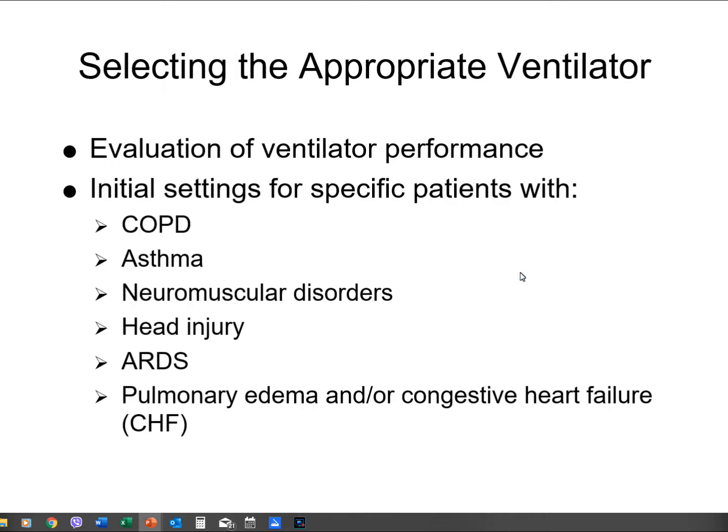So, there are times where certain bosses will assign someone to look at, let's say, the intubation tray, make sure everything's working, make sure the laryngoscope lights are working, the batteries are okay. You have all the different sizes of endotracheal tubes. You have the different sized sterile gloves for the doctors. All that stuff we have to double check and make sure, just in case, so that when the emergency happens, we have all the equipment there.